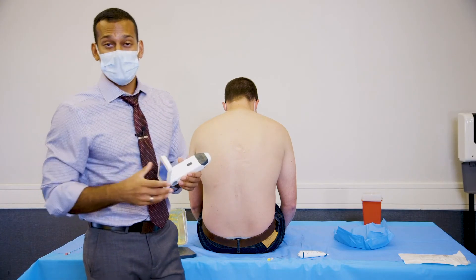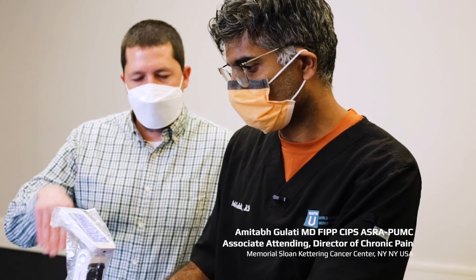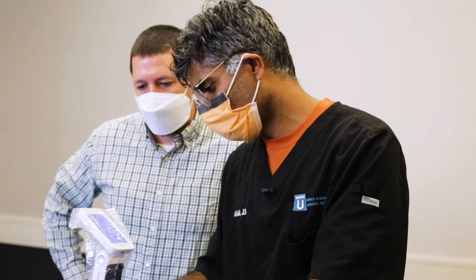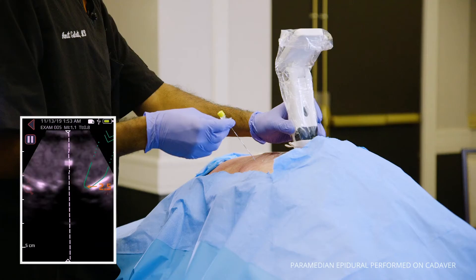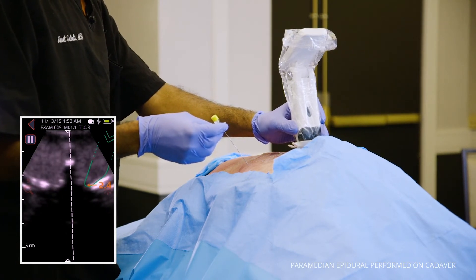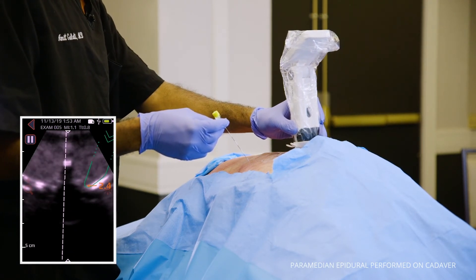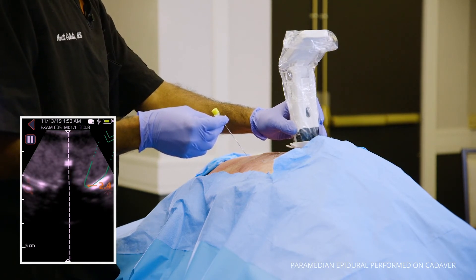Now to go through this further, I'm going to hand it off to Dr. Amit Gulati. Today I will be showing you how to place a thoracic epidural using the Acuro ultrasound guidance system. Once you have the spinous processes in midline with the Acuro system, you will notice that once your device has identified both the spinous process and the thoracic lamina, it will give you guidance — a green image for the needle track indicator — and then an orange depth indicator telling you the depth of the lamina from the skin.